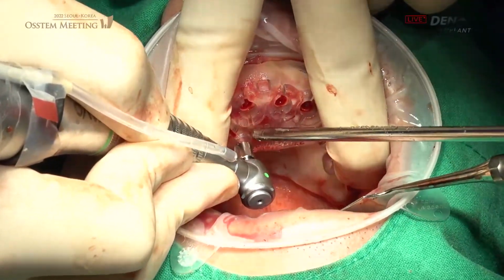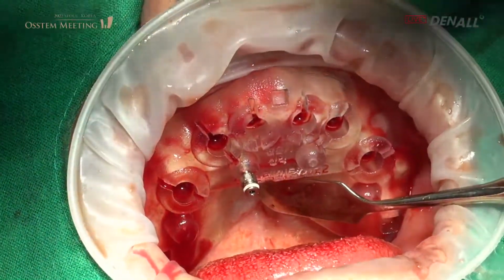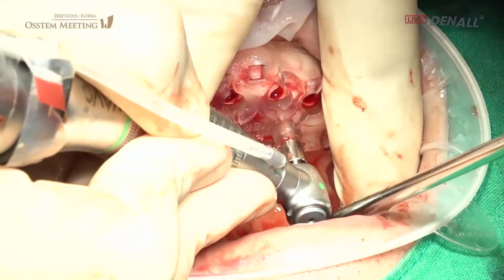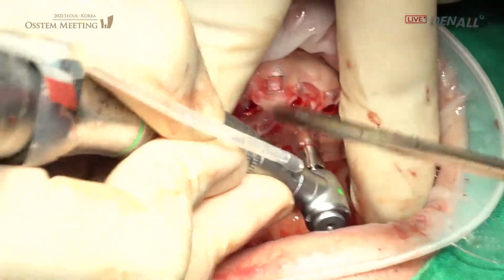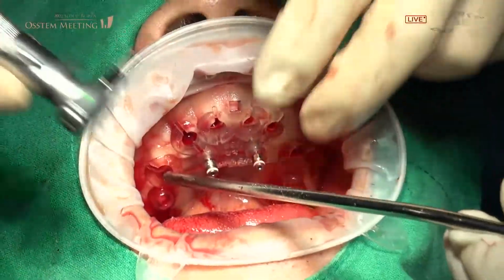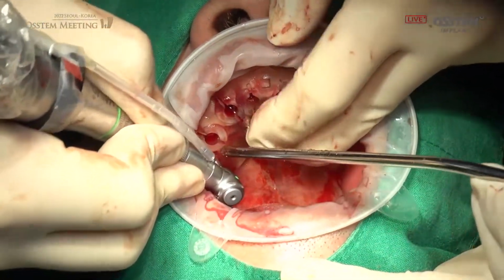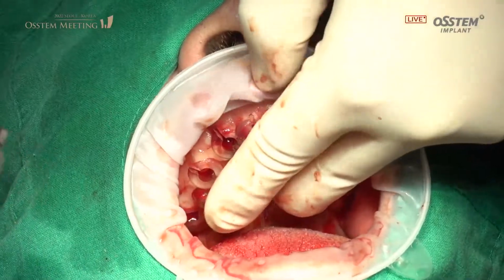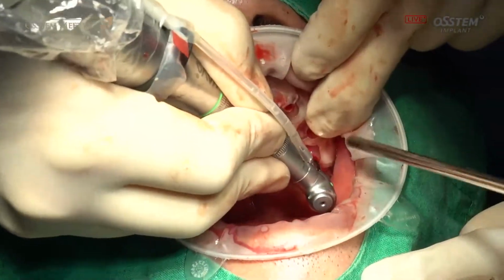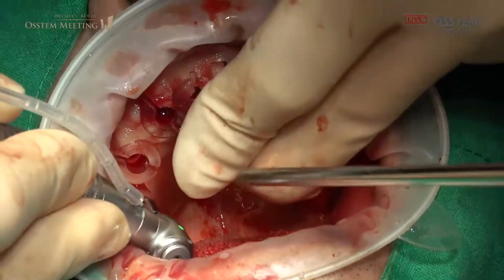Anchor screw design: it is not to be inserted in a slant way. If it is designed obliquely, the guide can shift while it is being pushed in. Open your mouth, please. It's a lateral anchor, but still without deviation. It is designed in a straight way.